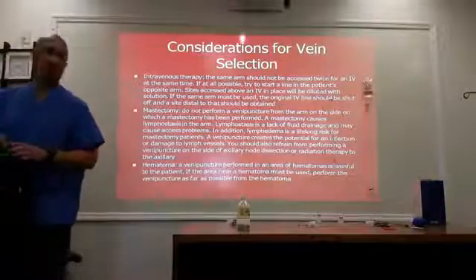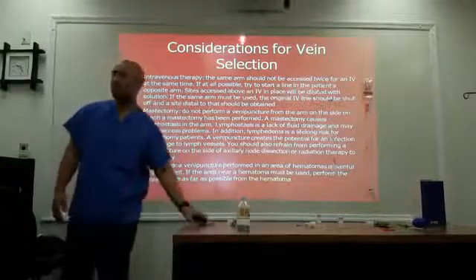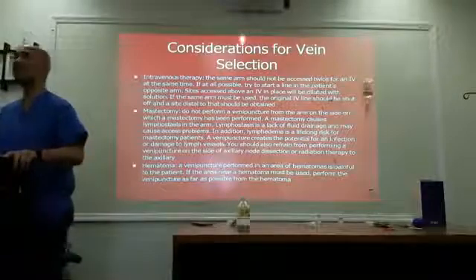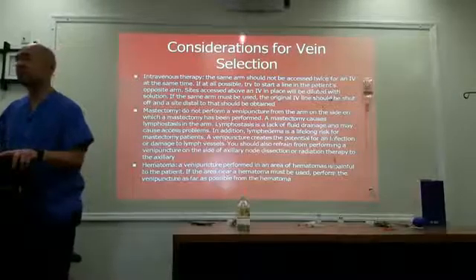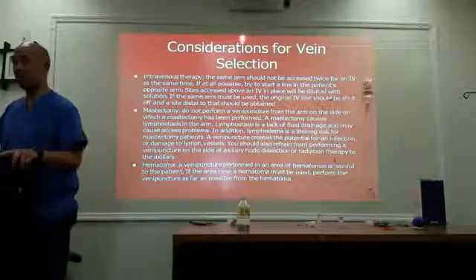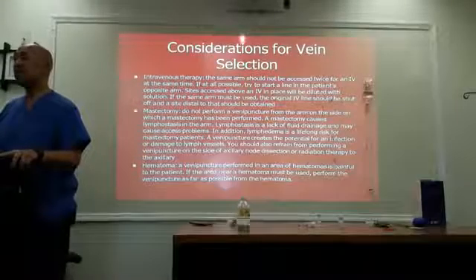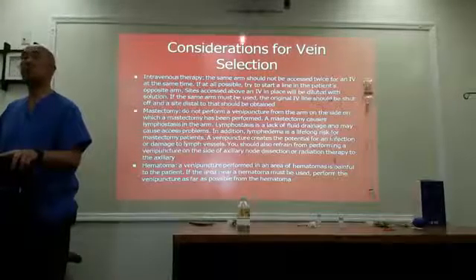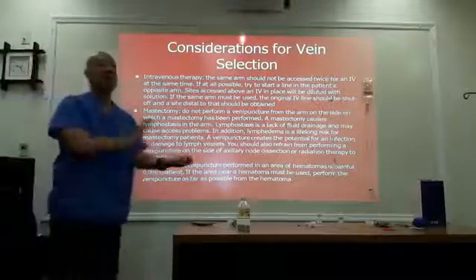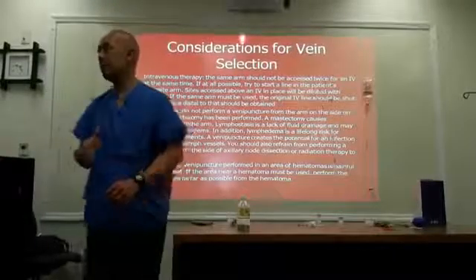Considerations of vein selection. Okay, number one is the type of therapy that you're going to administer. The same arm should not be accessed twice for an IV at the same time. If at all possible, try to start a line in the patient's opposite arm. Samples drawn above an IV, if there's an existing IV in place, will be diluted with the solution of the IV that's already going in there. So again, if the patient's coming down with an IV, try to go on the opposite arm. Okay?